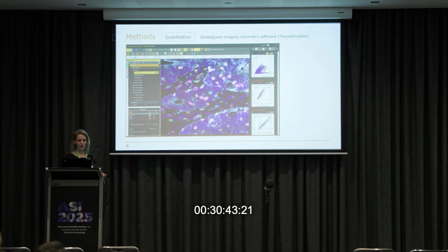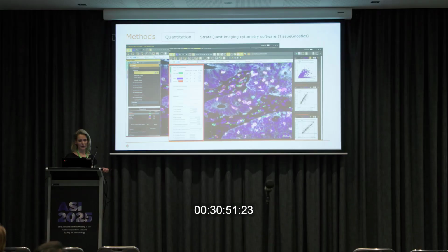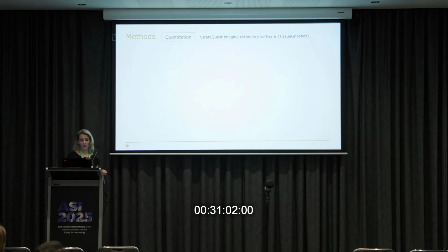So I said before it can be quite complex. So here is what we call the advanced mode of our software, where I have all of these layers and all of these different engines and things that it's doing. But if I'm training up a student to maybe check their analysis and maybe look at annotations, I can build this easy user interface so they can just click a few buttons and check a few things, and it will work out of the box, which is quite a nice thing to have.